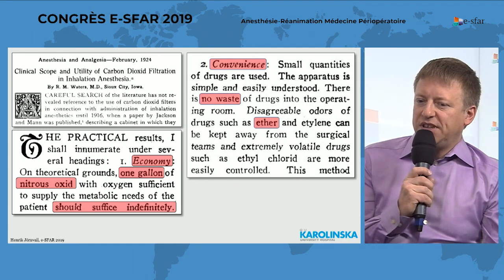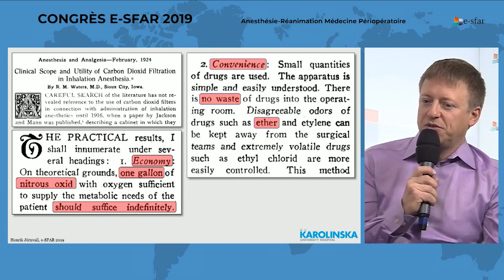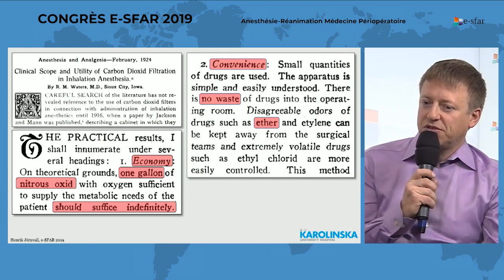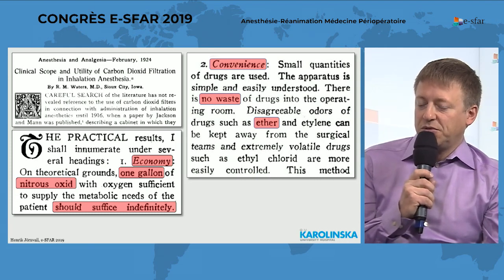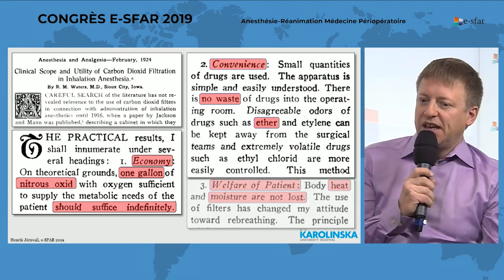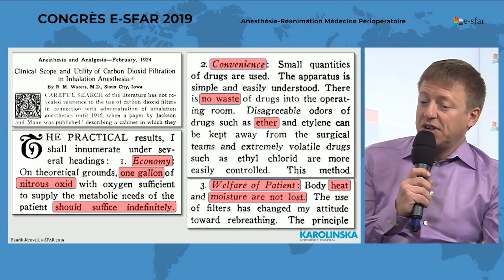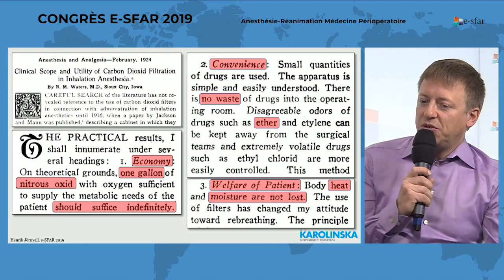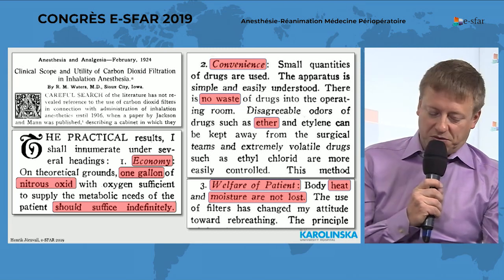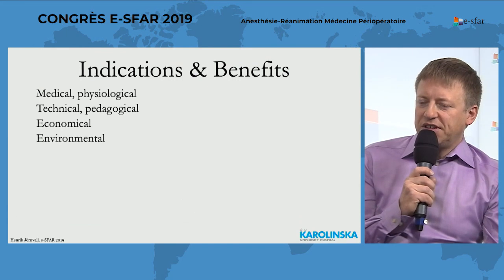And also convenience, because you have no waste. He was, of course, concerned with ether and explosion risks and stuff like that. But we are concerned with the environmental footprint, and we're also concerned with the worker environment and so on. And finally, the welfare of the patient. So there is no heat loss or less heat loss. The moisture is not lost, and there are only, I would argue, benefits, with one exception, which I will come to.